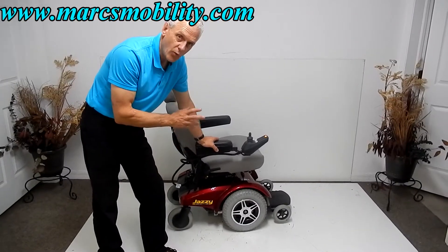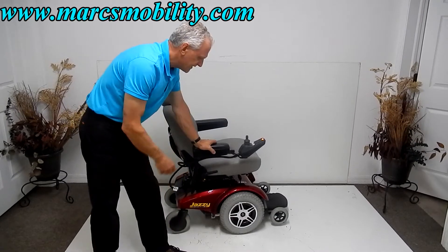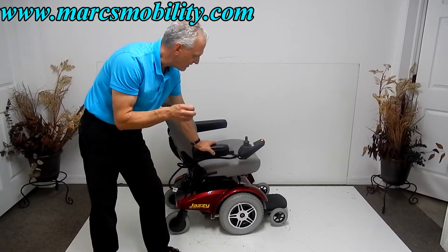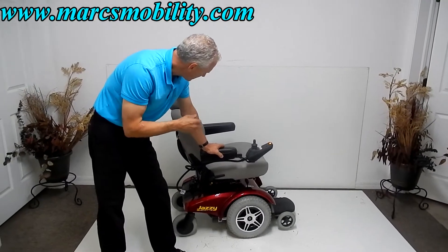This is a Jazzy Select 14 XL. The XL stands for extra large. This power chair has a 400-pound weight capability. It's a very sharp power chair and we've sold a lot of these.